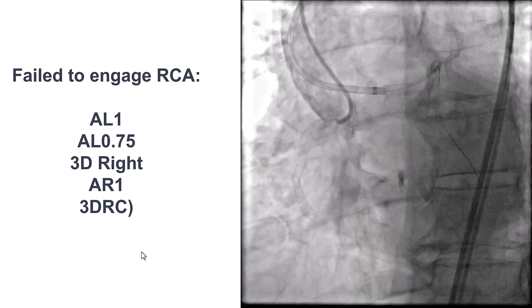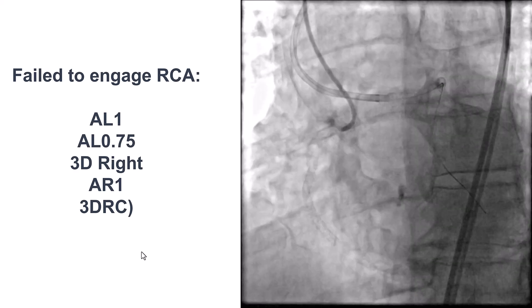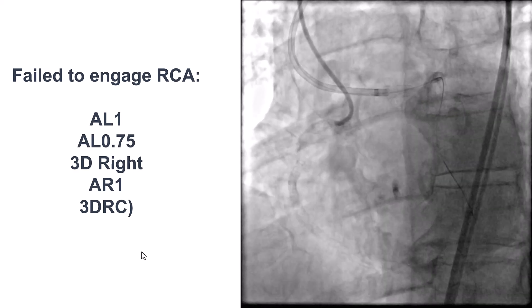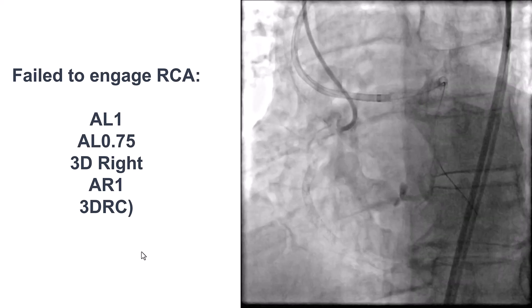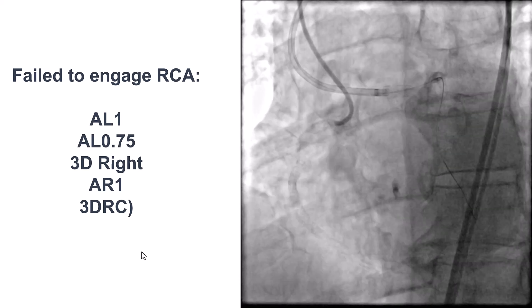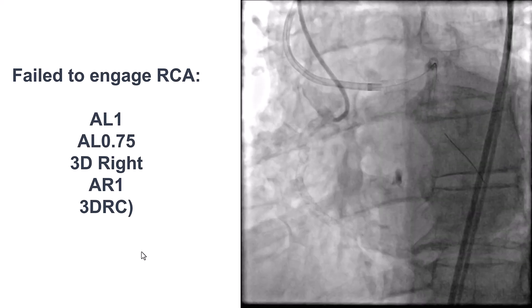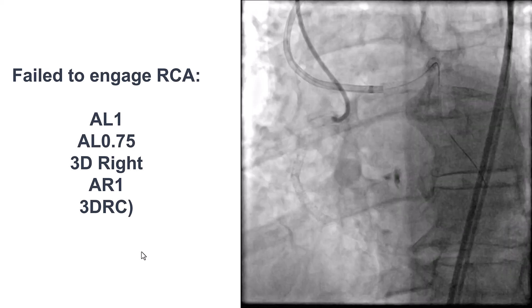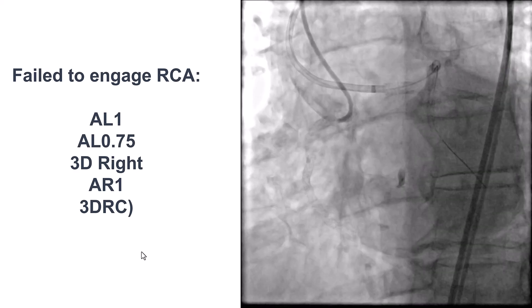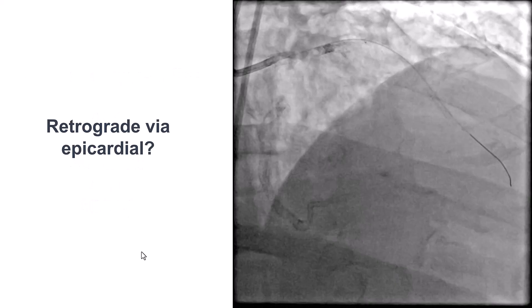At this point, we gave up on retrograde crossing attempts and tried to see if we could find some nub to engage in the antegrade direction. We used multiple guide catheters — AL1, AL0.75, 3D Right, AR1, 3DRC — but unfortunately we were unable to find a stump. It appeared that the occlusion was at the aorta without any stub.